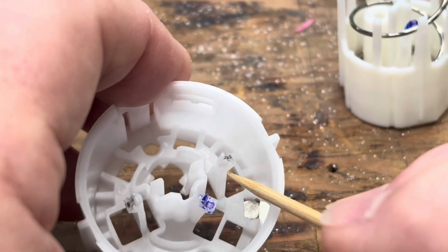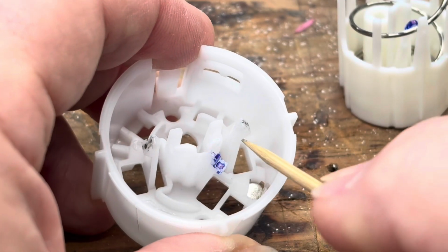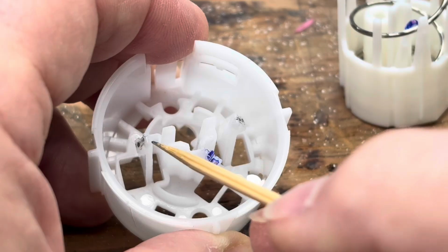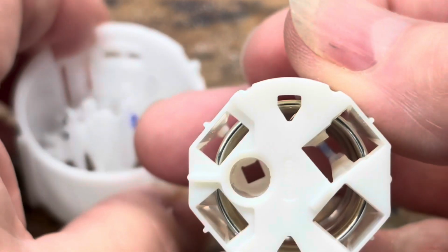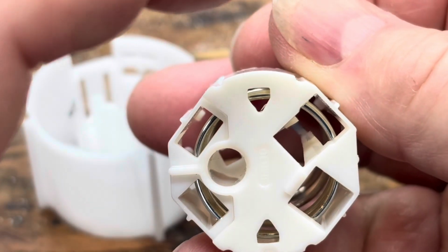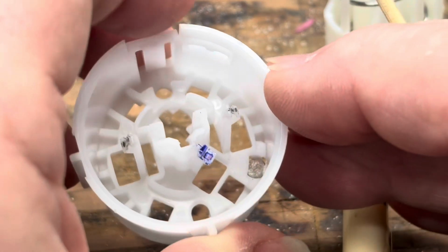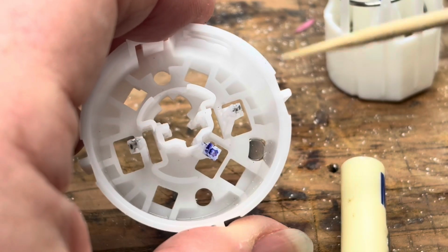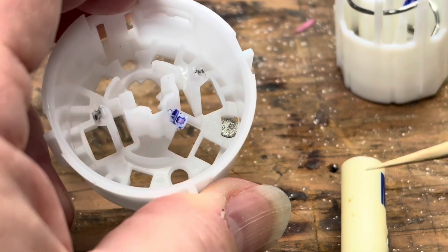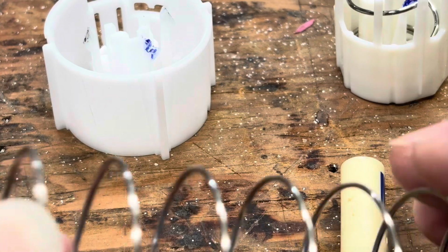around the outside of these 2 prongs, fingers I'll call them, and hooks under these shoulders, and that exerts inward pressure, a pinch motion, and then these 2 pinch points fit in those corners, and this mechanism presents outward pressure, which holds the spring in an unarmed position until a tab I'll mention in point 2 grabs on, and cup 2 grabs on cup 4 and arrests its travel and releases the spring mechanism between 3 and 4. This is the spring between 2 and 3.